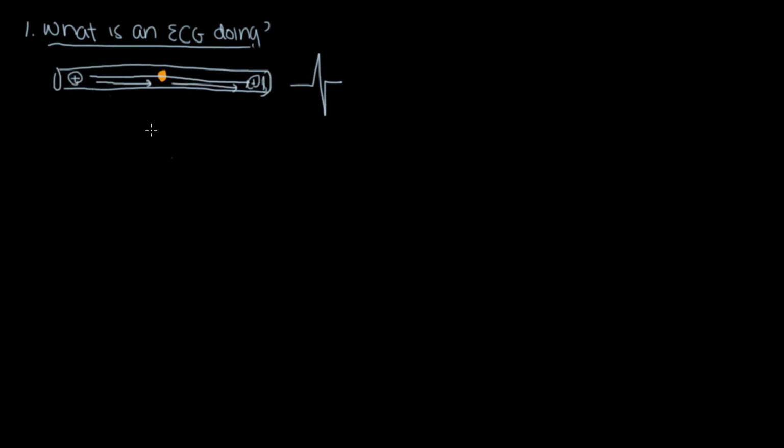So there are two important caveats to this. Caveat number one is that this sensor is only able to detect things moving toward it or away from it in one dimension, or one direction. What that means is we had, in this example above, the convenience of this tube and sensor being along the axis, or this charge is moving along the axis of the tube and the sensor.